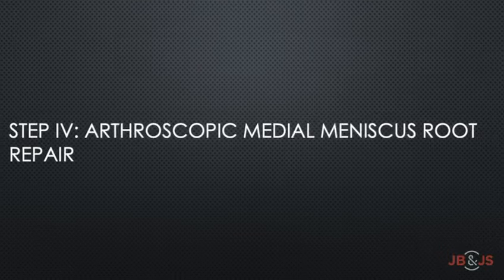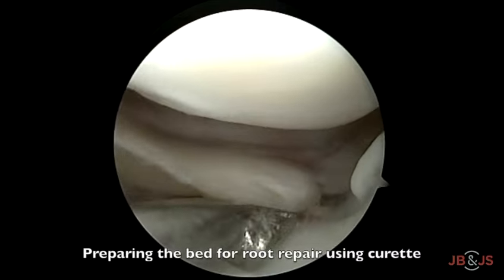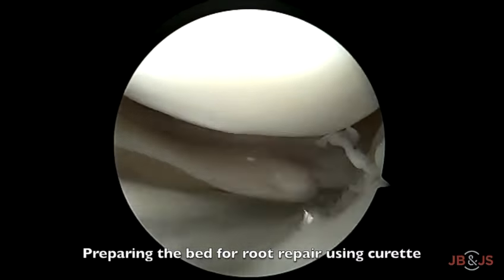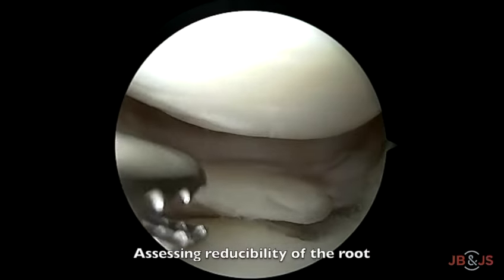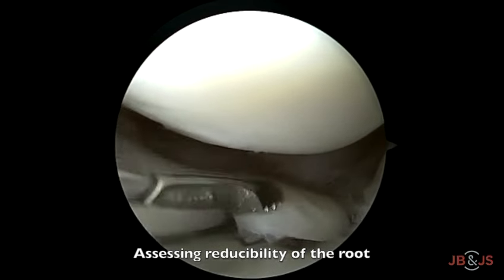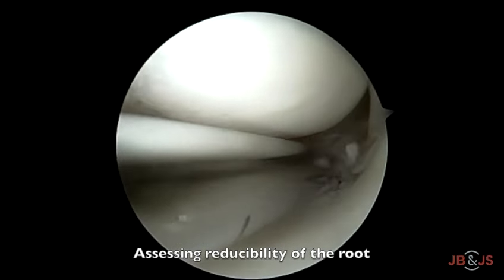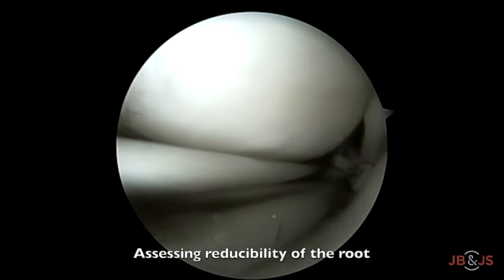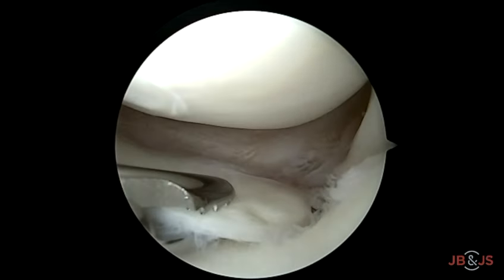The next step is repair of the torn meniscus using the transtibial suture pull-out technique. The tibial surface is first prepared using a curette just medial to the attachment of the posterior root. Reducibility of the tear to the native insertion site is checked using a grasper, as non-anatomic repair can result in altered knee biomechanics. In case of extensive scarring and extrusion, partial release of the root may be necessary. In our case, the root was easily reducible to its native anatomic site.